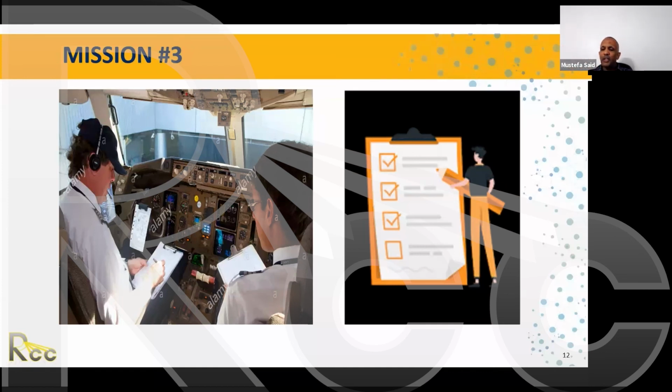patient setup perfect, talk to each other out loud. If the patient has a stent, ask the patient, please give me the name. If they don't understand, put it in the mouth. I don't advise you to put it in the patient's mouth yourself, because if they have some kind of lesion, they would know. So give it to them so they can maneuver it into their mouth. And check the mouth. If there are borders, check that one. Everything. Speak to one another, do it out loud inside the room.